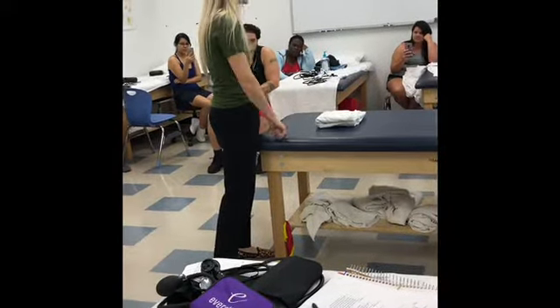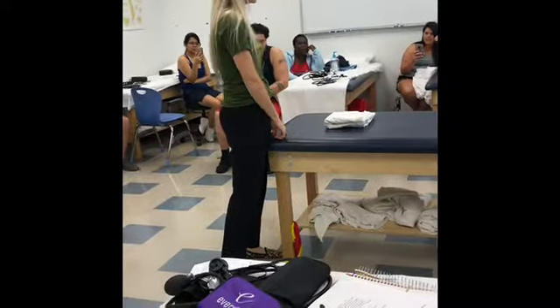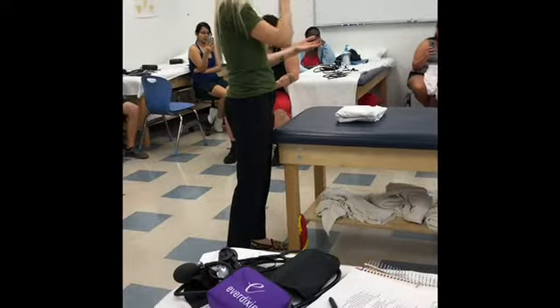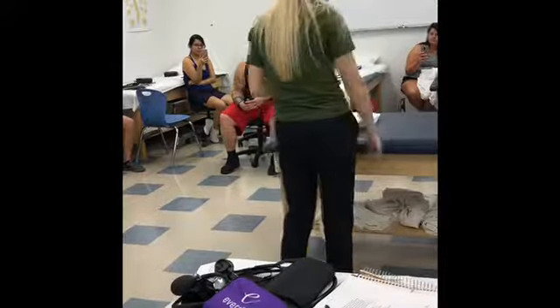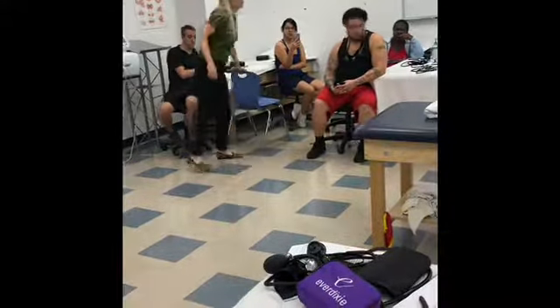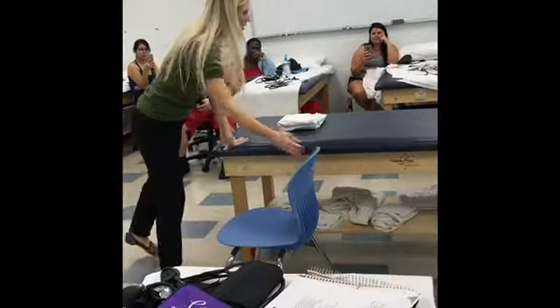Do I know which arm I'm assessing blood pressure on? Right side. Okay. So if it's me, I'm going to draw a big R on my paper and circle it so I know what the right side is. And I know that if it's his right arm, I need his chair set up here. So I can go grab a chair and get my area ready before I even go grab Q from the waiting room.